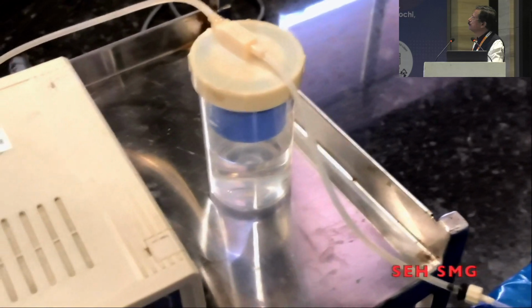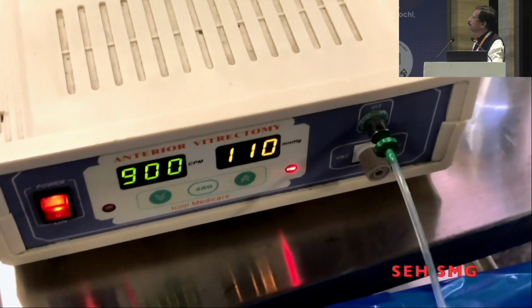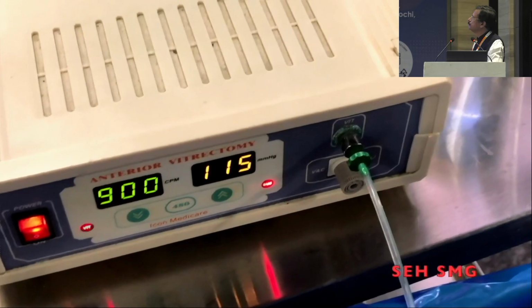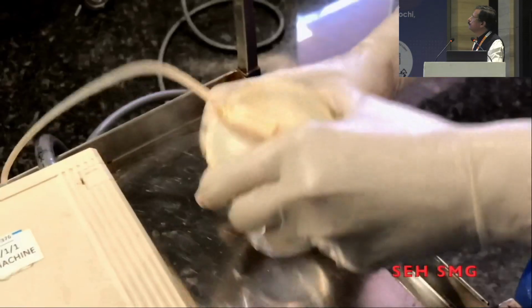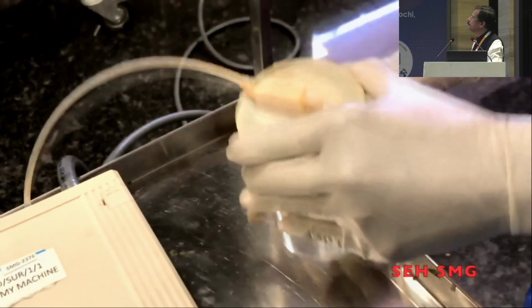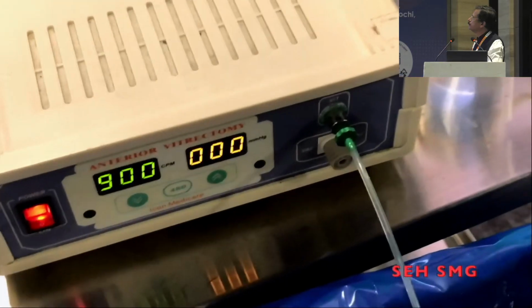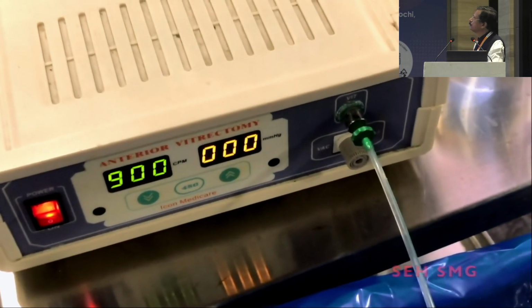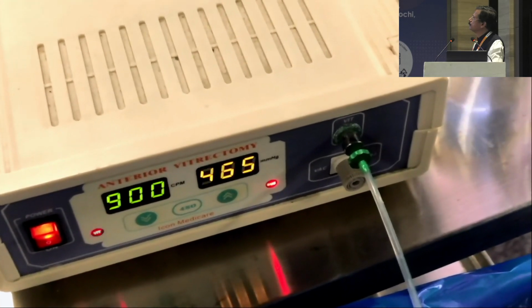Now everything has been connected, but the vacuum is not generating. So you have to recheck again. Probably the cap of the vacuum bottle is loosely capped. So you have to tighten the cap and check again. Now the vacuum is slowly building up.